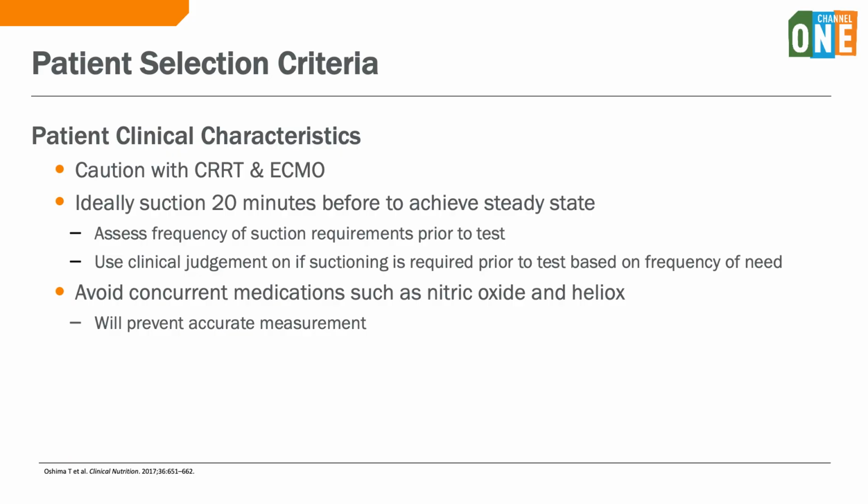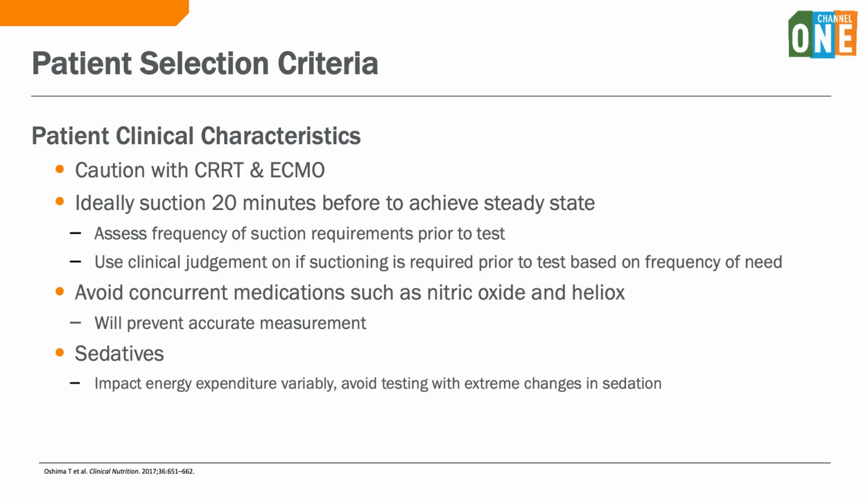When suctioning a patient, or if a patient is repositioned, this should be performed about 20 minutes before measurements are completed to ensure that the patient has returned to a steady state. Additionally, sedation should remain stable, as changing the sedation again can affect our indirect calorimetry results.